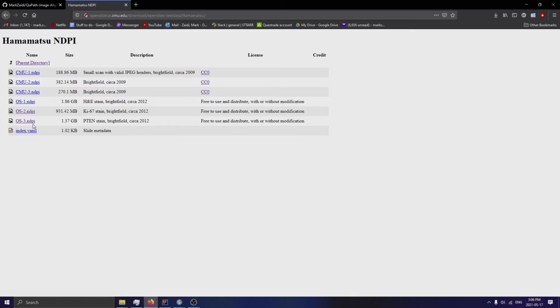a TIFF file. But the great thing about this image alignment program is that whether you're working with NDPIs, SVSs, TIFFs, whatever, as long as you're able to get it into Qupath, you'll be able to align the image to a reasonable extent. Again, it depends on the quality of tissue morphology, signal to noise ratio of your stain of interest, and several other parameters. So yeah, we'll give this a shot, but by no means is this guaranteed to work for any range of images.